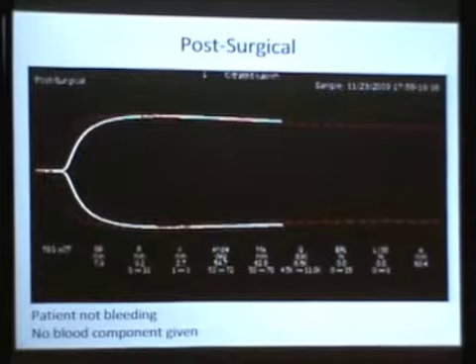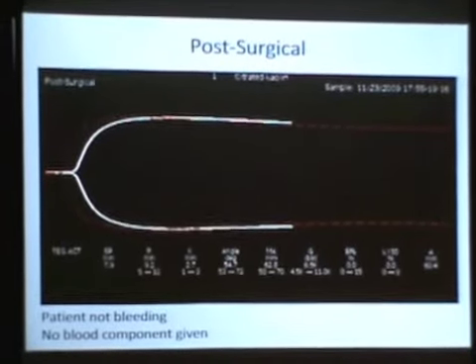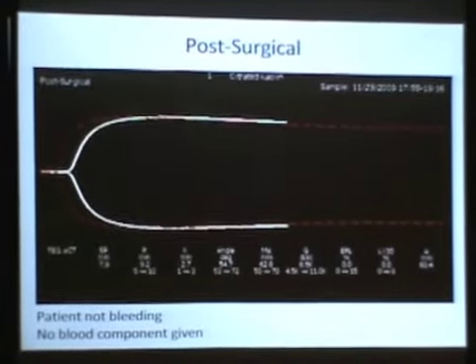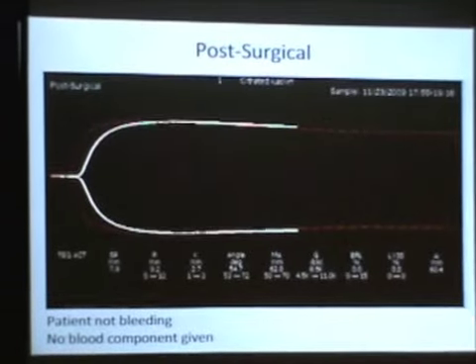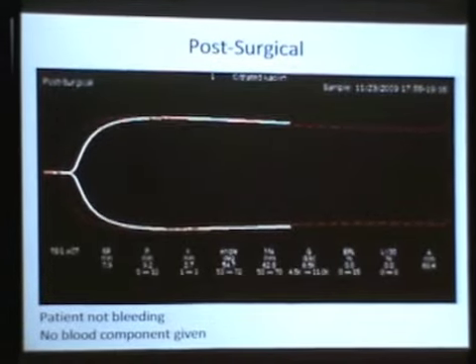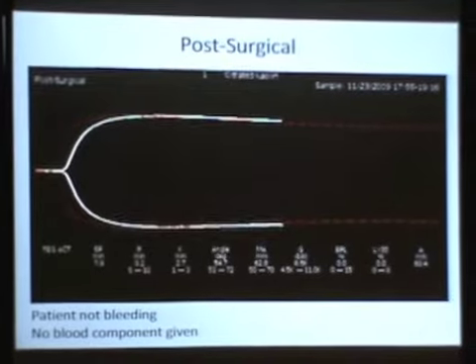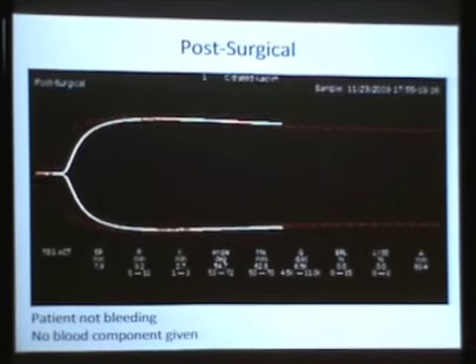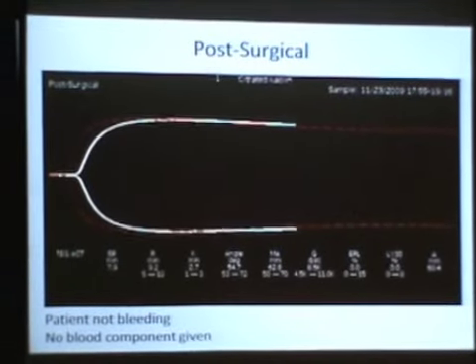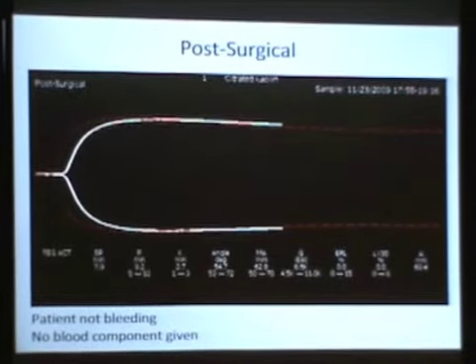He started oozing, and what's going on with this guy? And it came out with an extremely long R time, very, very low MA. Rebecca Zubin was standing beside me while the curve was running. We were looking at it. Oh, look, that's heparin effect. Why'd you give him heparin? We didn't give him any heparin. He's a trauma patient. Well, liver damage, I said. Tim and Phil taught me that this is endogenous heparinoids from the liver damage. The body produces these things. Give him protamine. They did, and it came back to normal within minutes.